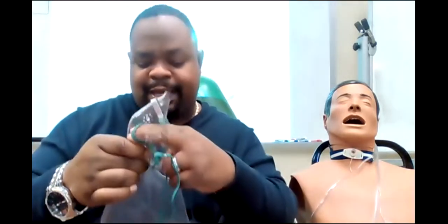Okay, you need to increase the flow, and if he keeps on doing it, we need to go to a high flow device, right? Because it depends on his ventilatory pattern. Now, if he's breathing and it's collapsing, I can increase the flow. If I increase the flow and it's still collapsing, it's time to move on to a high flow device, okay? He has graduated from low flow. Now we need to get into the high flow systems, okay? But this is still a low flow device called the partial rebreather mask.